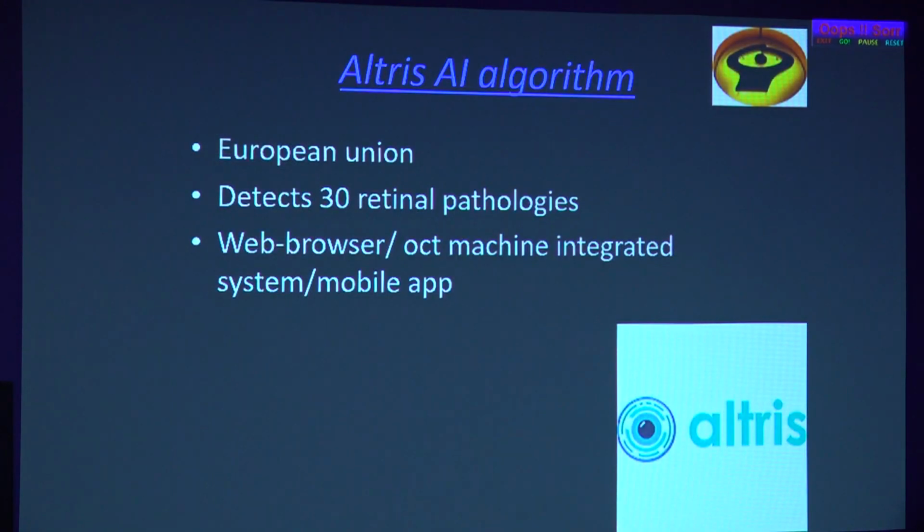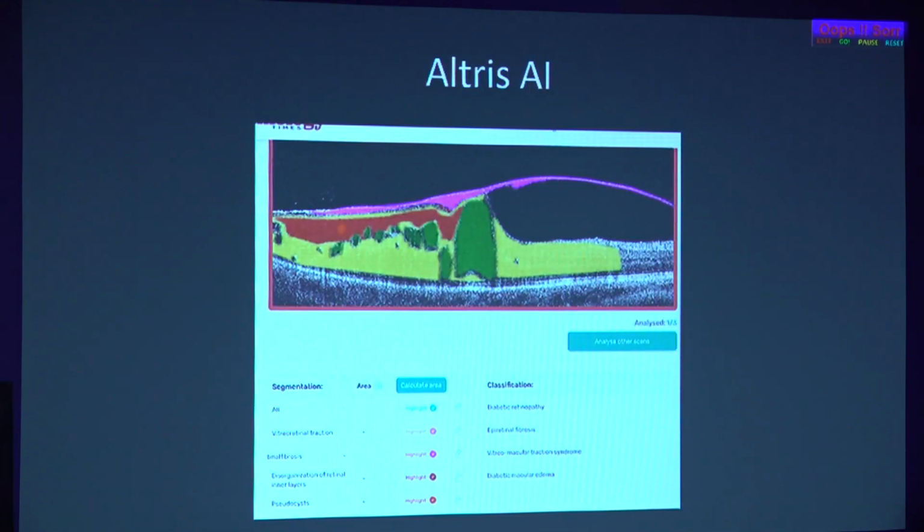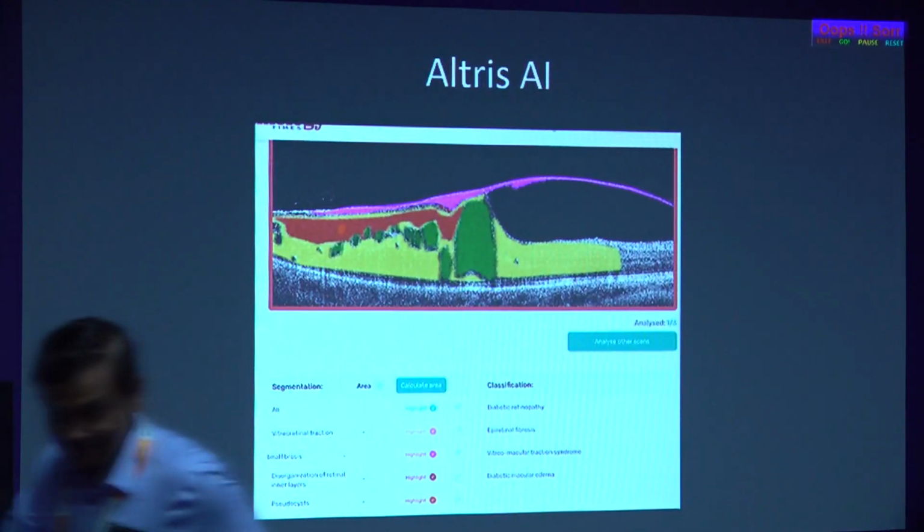And the Altris AI algorithm, the AI algorithm is now also available with the OCT, which is currently in the market, and this has been integrated with the Heidelberg's OCT, but this software can be used for any of the OCTs, and this is said to be 91.3% accurate as well, and it can detect up to 30 retinal pathologies.